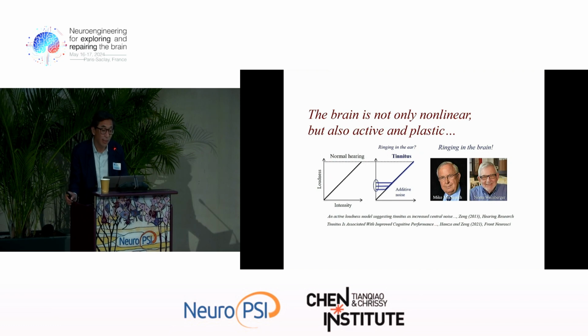Looking back right now, for the success of the cochlear implant, at most I would say half of it is attributed to us engineers. The other half, or perhaps more, is attributed to the plasticity in the brain. We delivered, and I'll show you in a couple of simulations, a very crude acoustic signal. Even the transformation through the cochlear implant is still very crude. Somehow, your brain adapts and learns that signal.